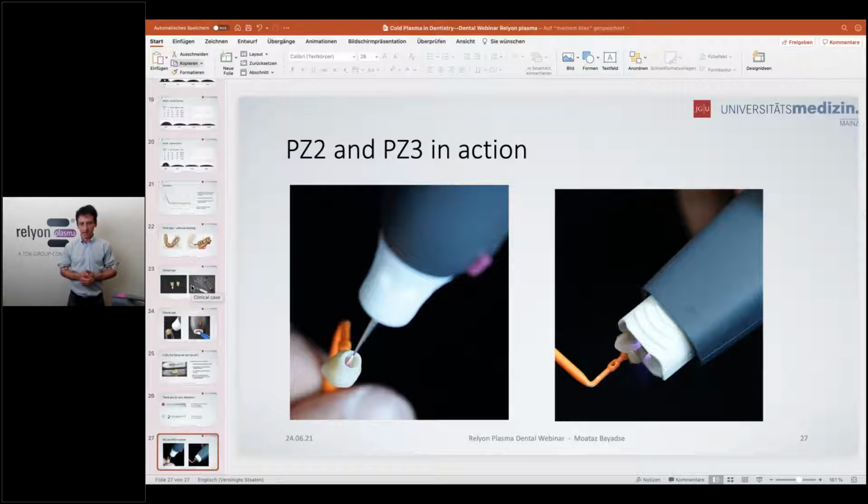from our research partner, Professor Dr. Smith at the UKE in Hamburg, and we have a clear sign that there is no toxicity on the surfaces after plasma treatment. These are still very new results from cell attachment studies which demonstrate no toxicity on the surface. That's it for the moment. So we will see later. Bye.